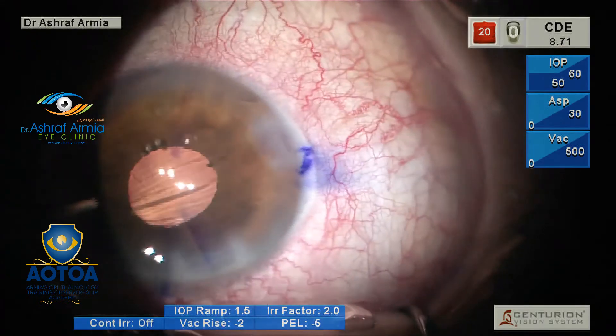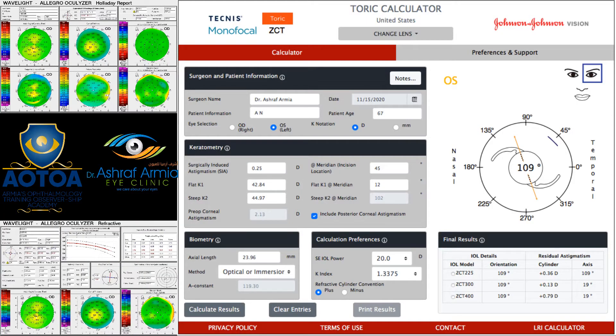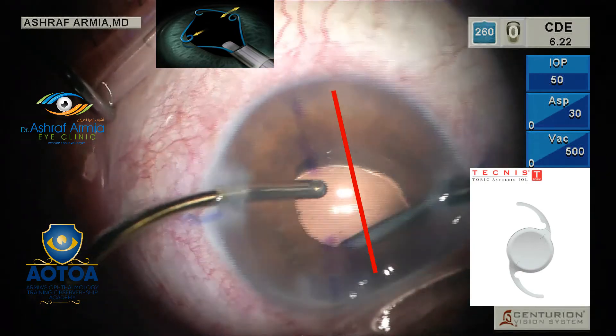After finishing the right eye, on another day I did the left eye for the patient. I did the same calculation and found the same result — 2 diopters of astigmatism on corneal topography. I used the T300 to correct the full astigmatism with the Technist Toric, and also used the Malyugin ring for this eye as well.